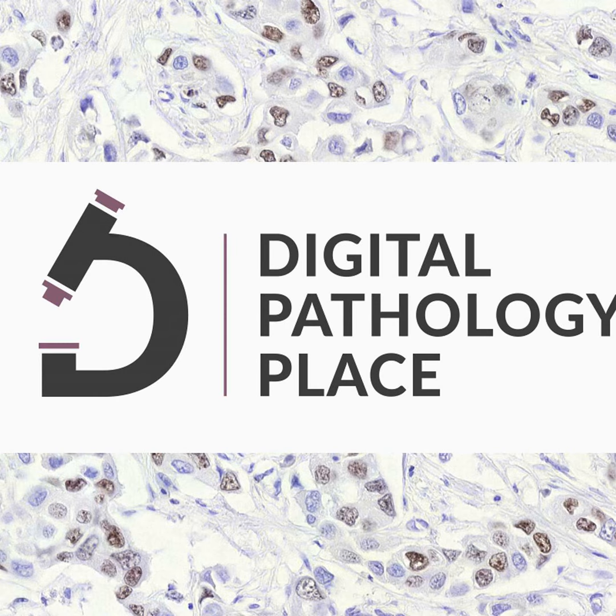And the goal of this trial is to check, okay, is this good enough? Is this as good as standard of care? And what they achieved here with this biomarker, this digital EGFR, detecting EGFR mutation status from tissue, was that they were able to reduce the number of rapid molecular tests needed by up to 43%.